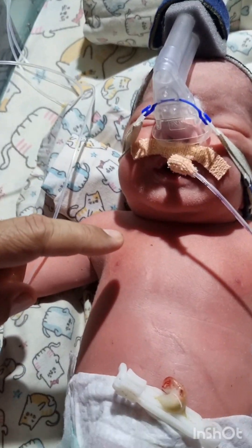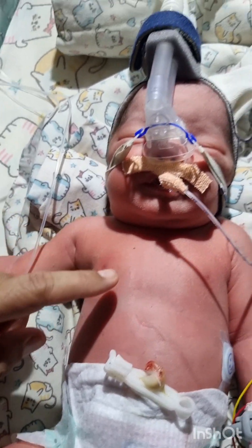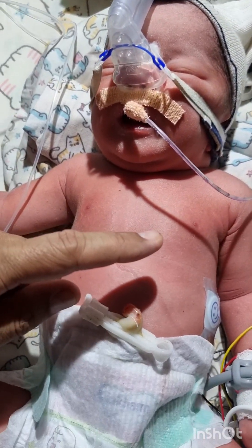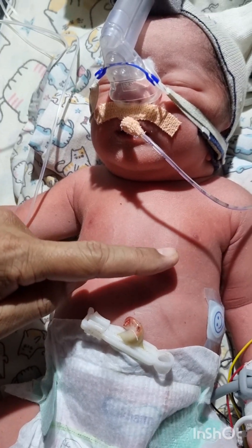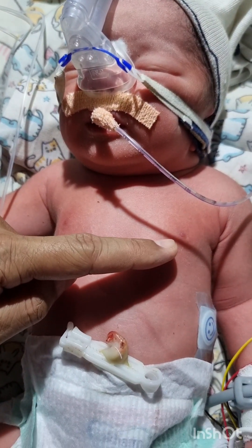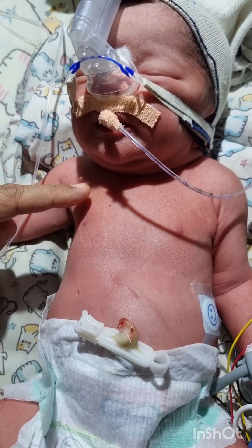For the SVC diameter view, it is a part of the high parasternal views. As we have already discussed, the high parasternal views are nipple line and above.